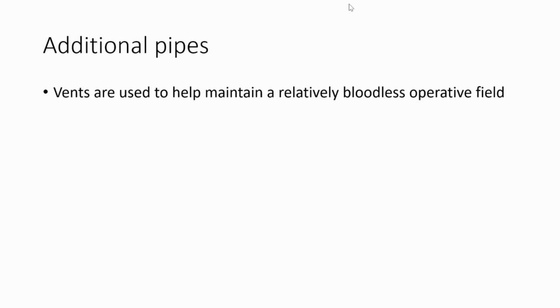And that essentially results in ischemia and death. So if you don't get this right, the patient dies. This is very important. So that's why we need to vent the left ventricle. Vent, think of it, it's just another way of saying suck or remove. You can think of ventilate, but it's just a term used in surgery, in cardiac surgery.